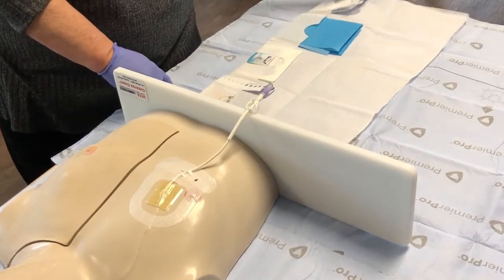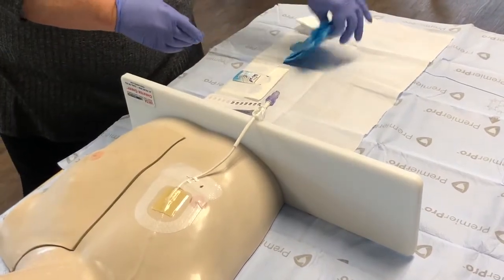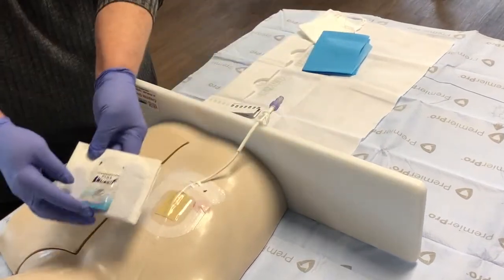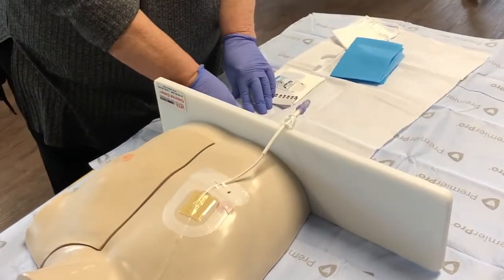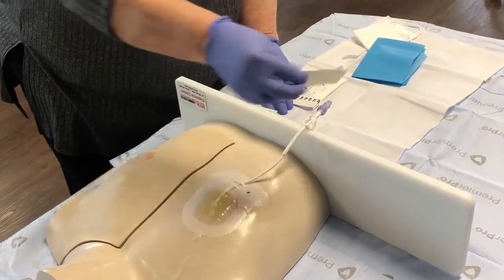Your dressing kit will include 2 masks, blue drape, clean gloves with a Purell gel, measuring tape, alcohol swab, and steri strips.